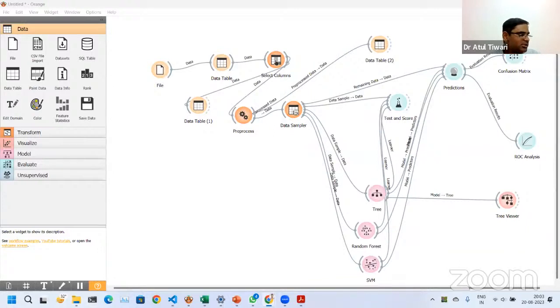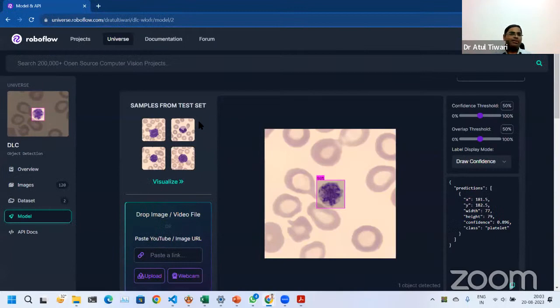Another question is whether it is possible to apply more than one model, one over another, to combine them. Yes, that's what I wanted to show you from this also. For example, this one was a complex model. If I want to make it more complex, there is a whole slide scan. First, I need to create a model that can identify that there is my tissue or my smear on the slide, differentiating between the blank glass and the tissue or blood cells. So the first model would be that one.